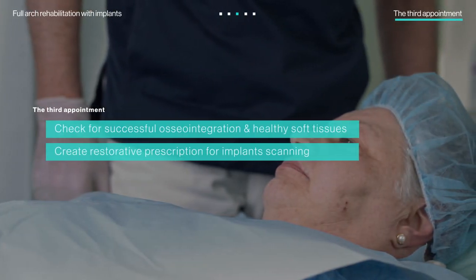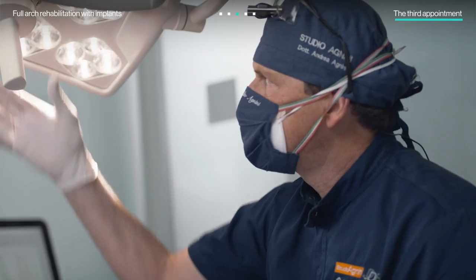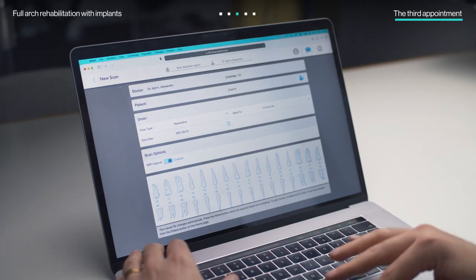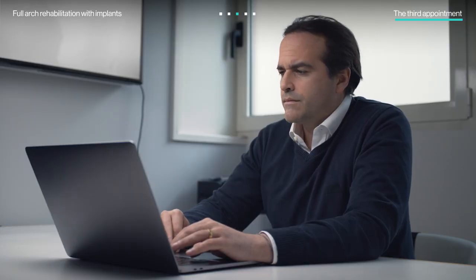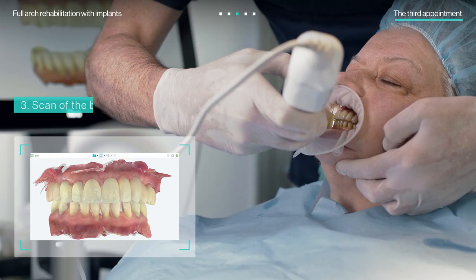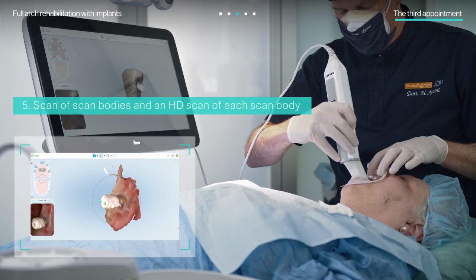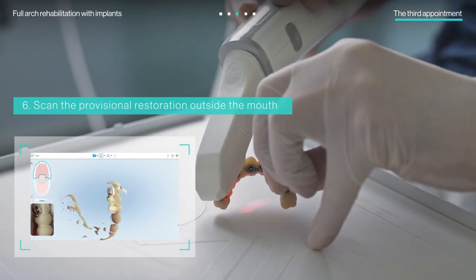Once the patient was healed, the doctors checked for successful osseointegration and made sure the soft tissue looked healthy and stable. They then created a restorative prescription for the implant scanning, entering all information pertinent to scan body type and desired abutments, before proceeding with the iTero scanning protocol: scan of the arch under treatment with provisional in place; scan of the opposing arch; scan of the bite; remove the provisional and screw in the scan bodies; scan of scan bodies and an HD scan of each scan body; and scan the provisional restoration outside the mouth.